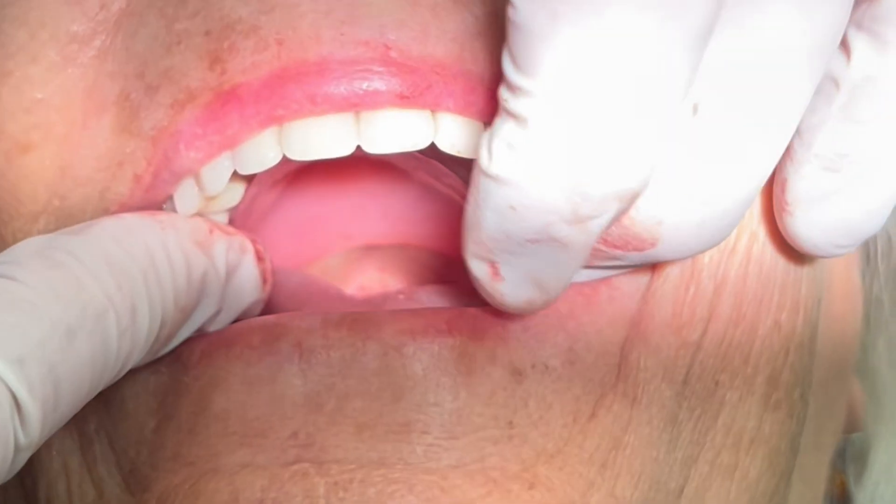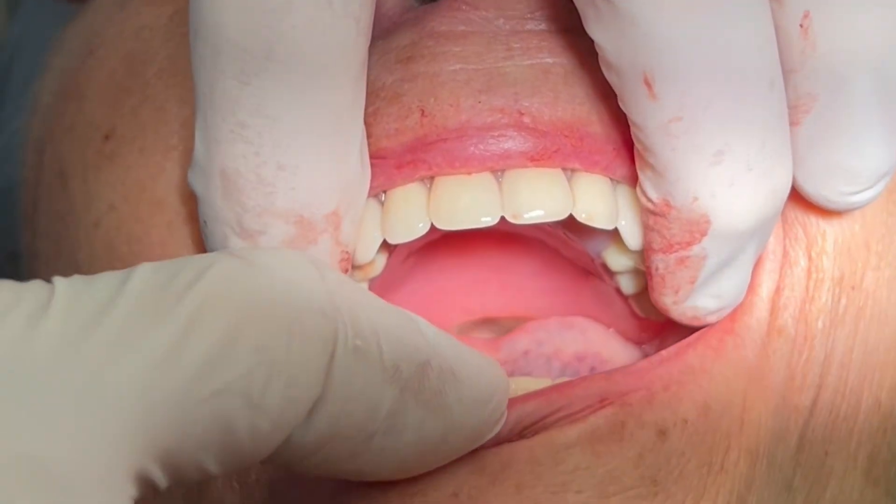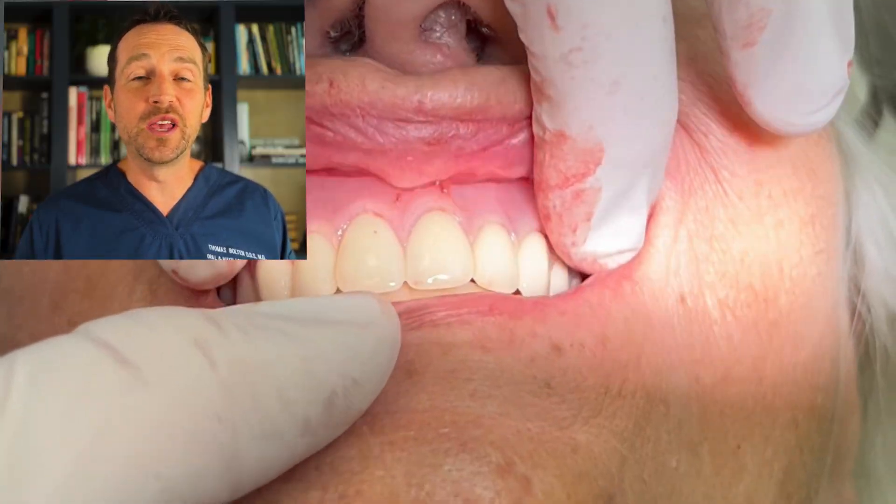Finally, I deliver the denture the dentist fabricated. She has a new smile and renewed function.